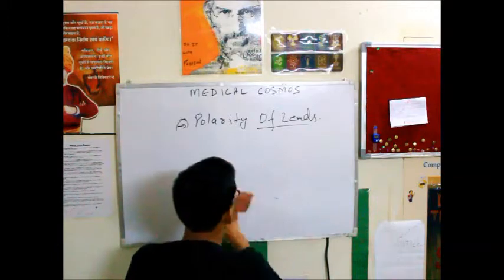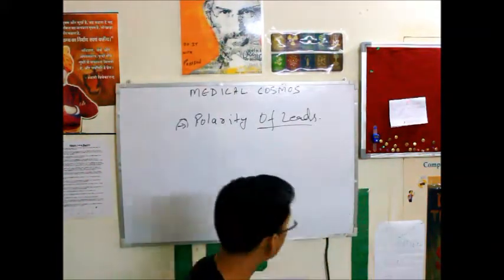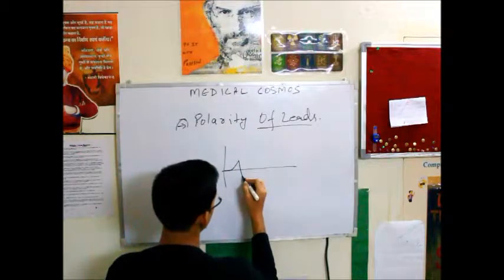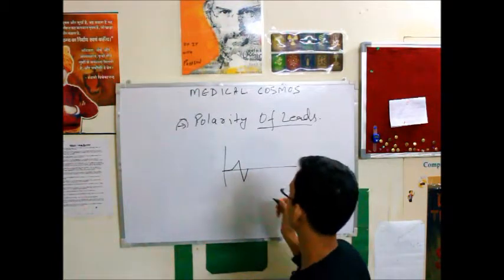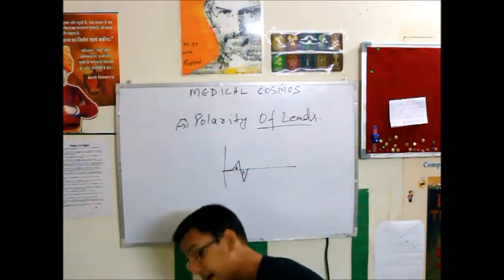Now friends, I would like to tell you about what an equiphasic complex is. When I was reading ECG, I was put at this point: for example, this wave, let me make it larger for you.